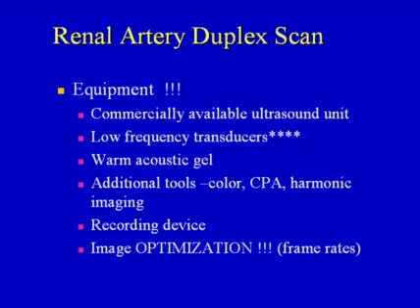Equipment. It is very, very critical to have state-of-the-art equipment.